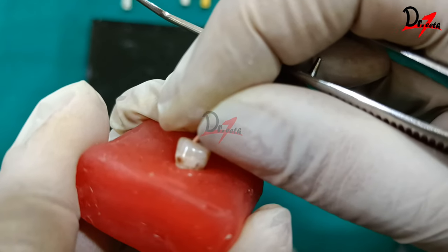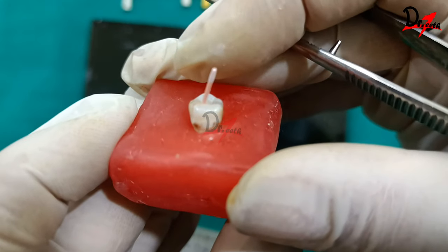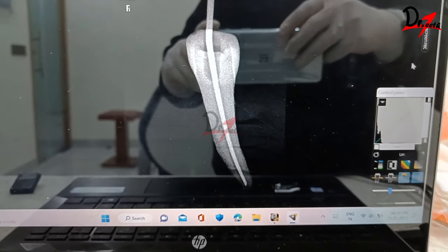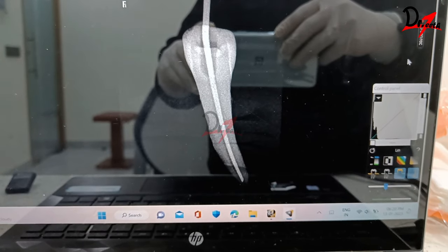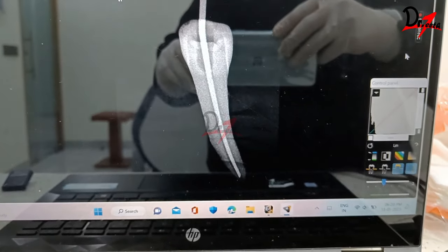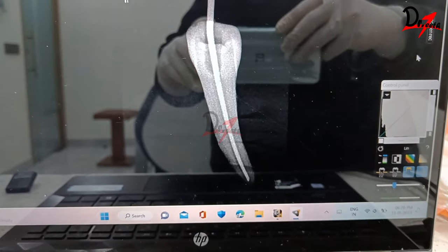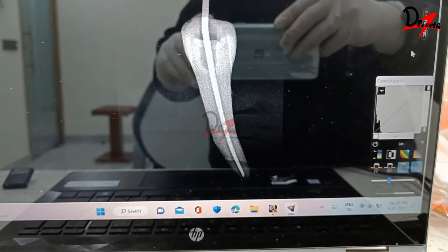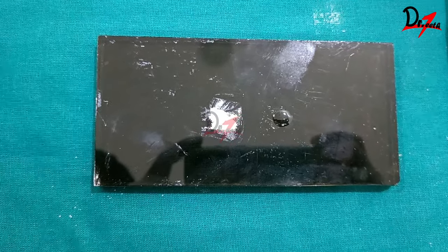I am getting a tuck back — a feeling of resistance when the master cone reaches the working length. You should feel this resistance. We then take a radiograph of the master apical cone. The radiograph of the #45 gutta-percha cone confirms it has reached the apex, is not extruded, and tuck back has been achieved. Now we can begin obturation.